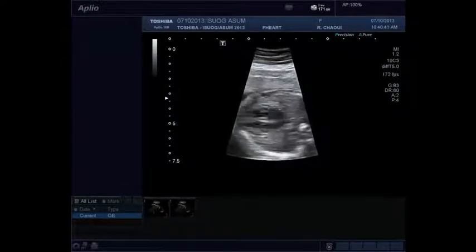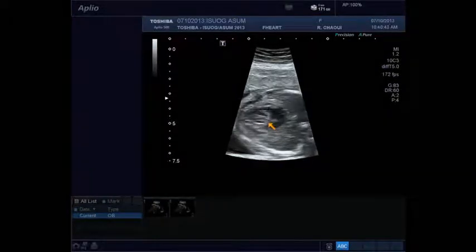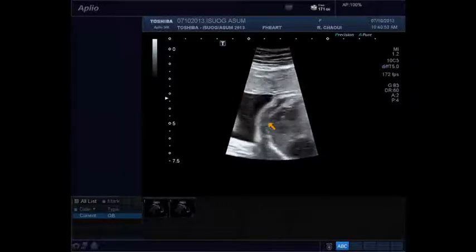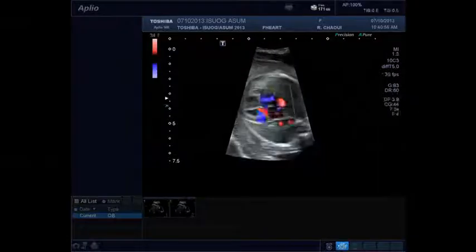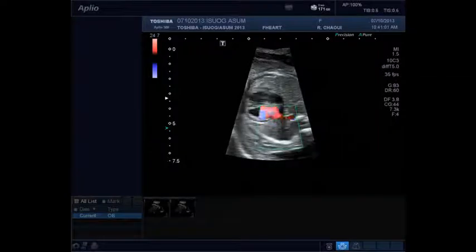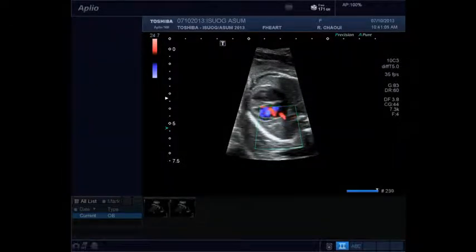For the left one, they are in general perpendicular to the interatrial septum. That means they will run into this part, and I will try to see it this way. Oops. Maybe stop moving now. Okay, and add the color here. If you know where to look, you can do the color very rapidly. The disadvantage of this position is that you need several planes to answer every single question, but in some conditions, if it's apical, you can do it straightforward within 1 or 2 sweeps.